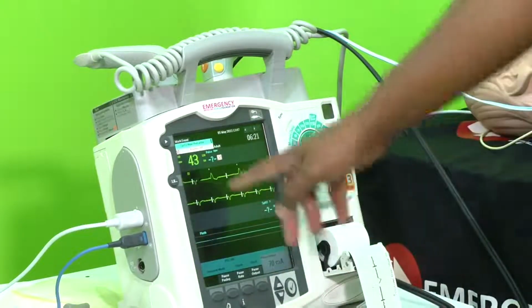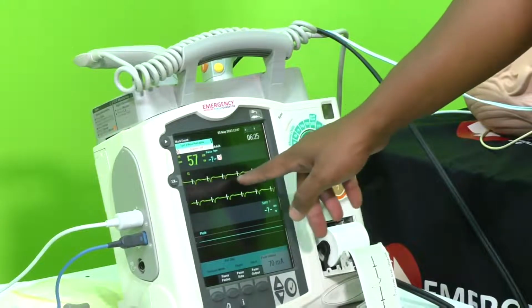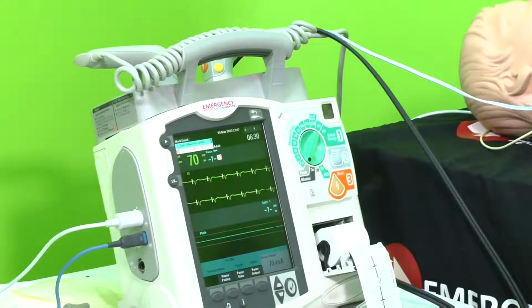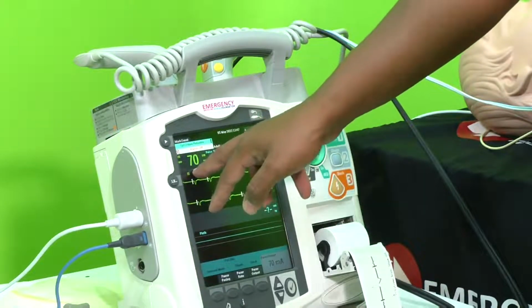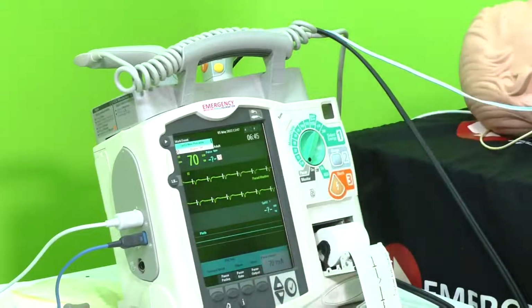In this I can see for every spike there's a wide QRS. So that means essentially every spike is followed by a wide QRS complex, meaning I have what we call electrical capture. You will also note my heart rate has moved from 38 to 70, which is what I had set earlier. So from a machine perspective, I have what we call electrical capture, meaning every spike is followed by a wide QRS complex.